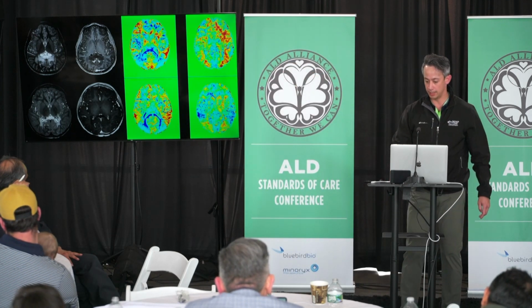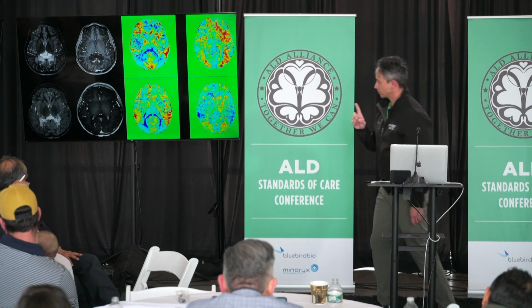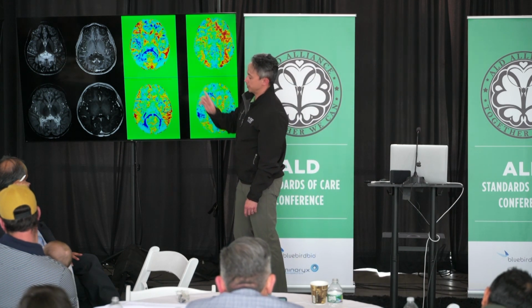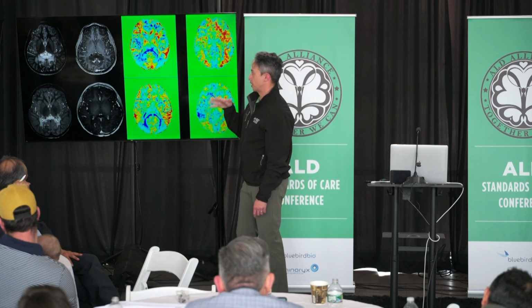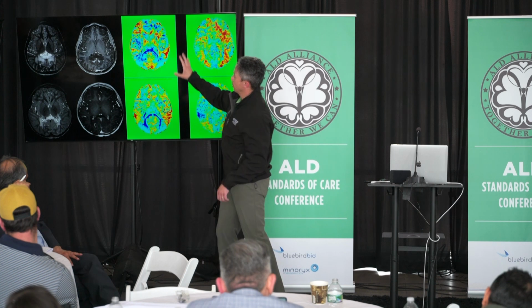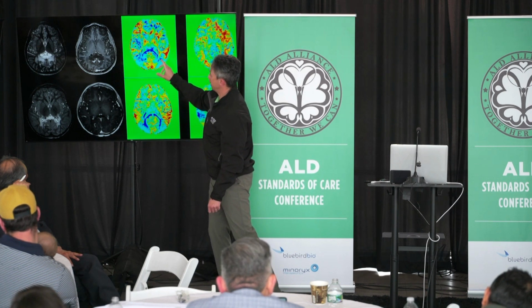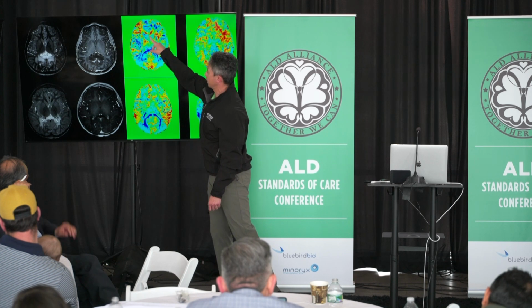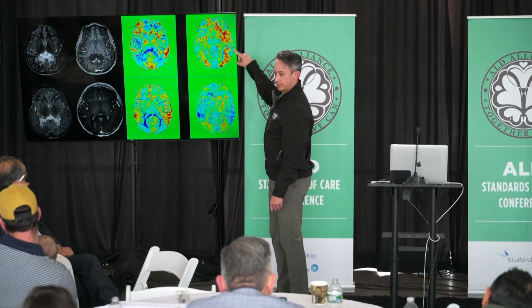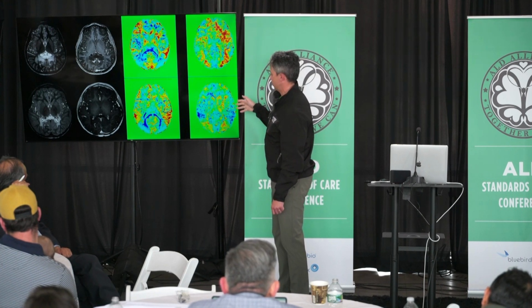I also want to mention one more thing. As you can tell, I'm still working through learning a lot about this and what I think these images mean. The elevations and drop-offs in the myelin signal tend to be around the lesion itself, or where we think the lesion's going to form. The iron signal is seemingly kind of random, right? It's just in the normal appearing white matter outside the lesion in no particular distribution.